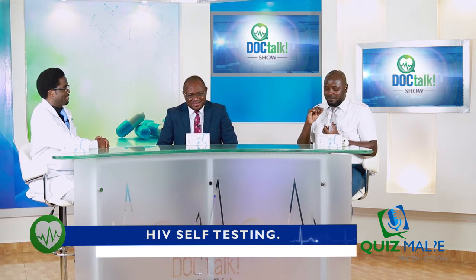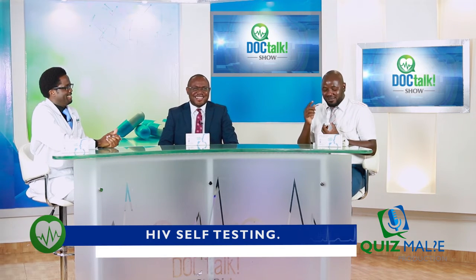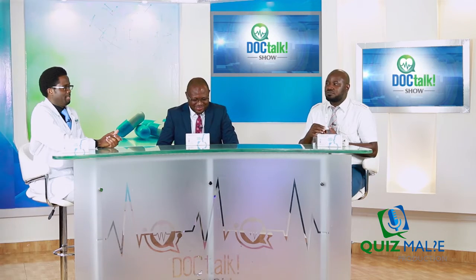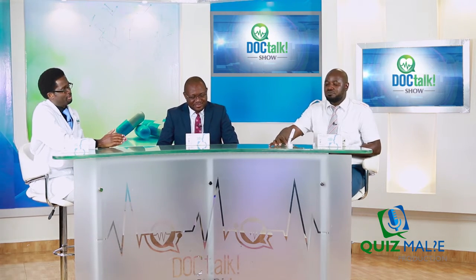Because for a correct test, the third one comes from where? I don't know. There has to be either one line, the C line, or two lines, at the C and the T. And the background should be white, very clear. So that is waiting for the 20 minutes until all the red has cleared, and then it is ready. Exactly, then you can read a clear test.